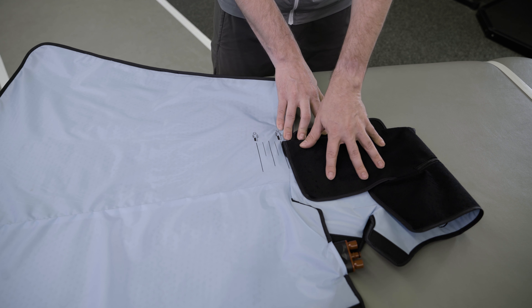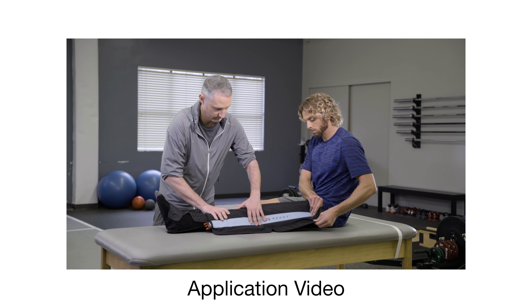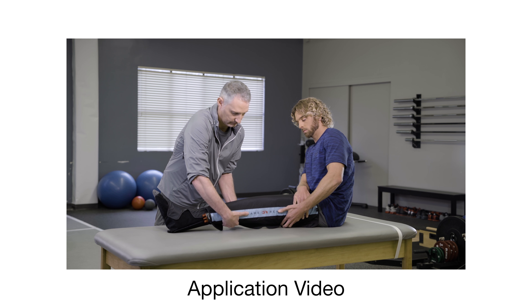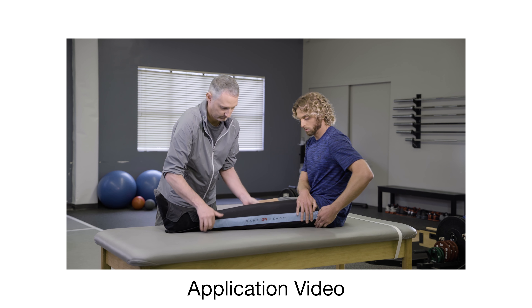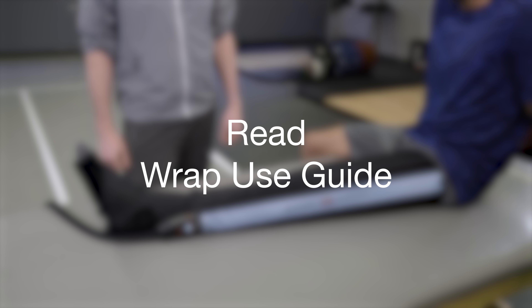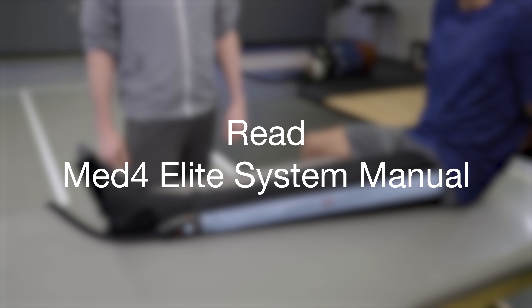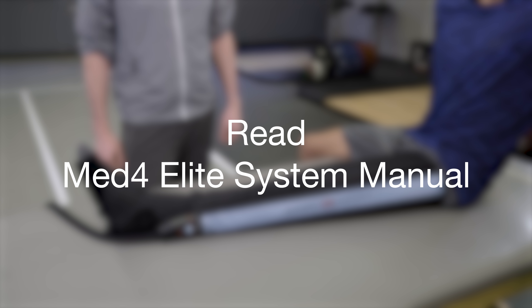For wrap application instructions, please watch the full leg boot wrap application video and refer to the wrap use guide. It is important to read the complete use guide in the GameReady GR Pro 2.1 System User Manual and/or the Med4 Elite System User Manual, including indications, contraindications, cautions, and warnings before using this product.